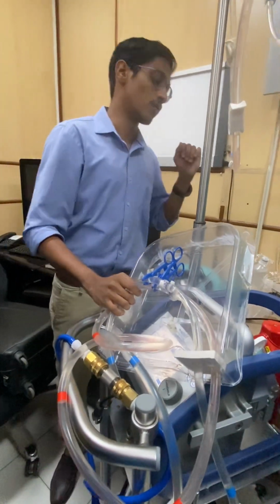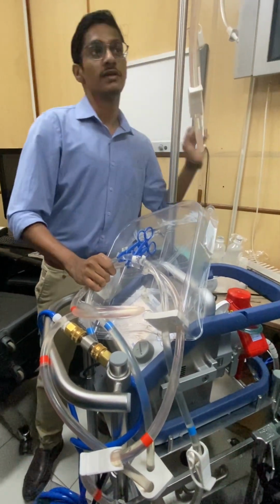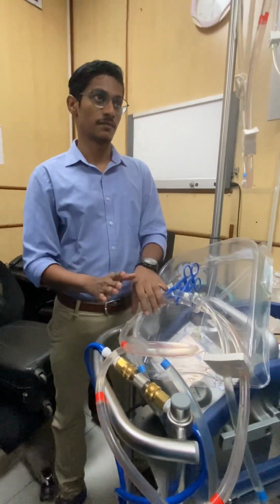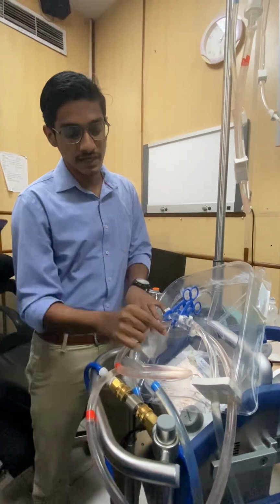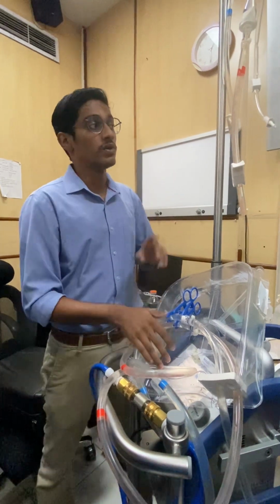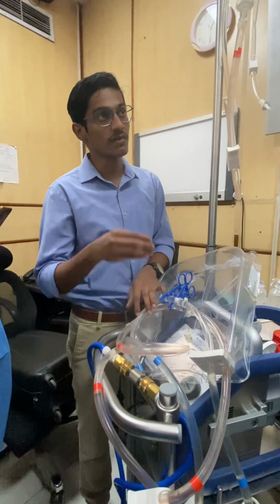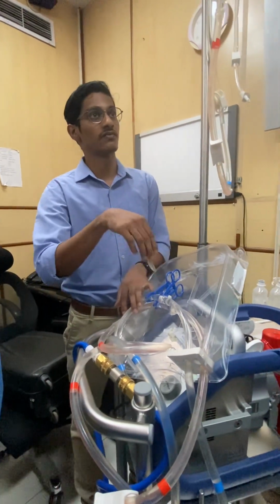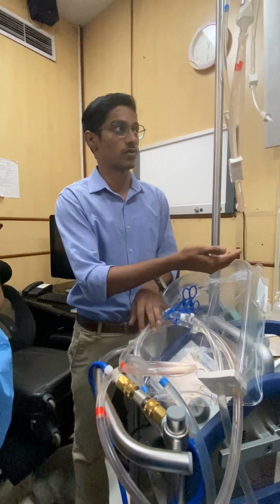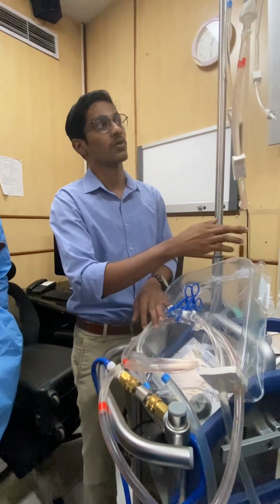Once we say go on ECMO, first we will take the venous clamp. By taking the venous clamp first, we make sure that the machine has preload. Then we will increase the RPM to the 1500 to 1600 range. Only after that we will take the arterial clamp. Once the arterial clamp is taken, we will increase the RPM to get the desired flow rates. For example, if you want to give 4 liters support, you will increase the RPM till you get 4 liters. You will check the hemodynamics, and then you are on ECMO.